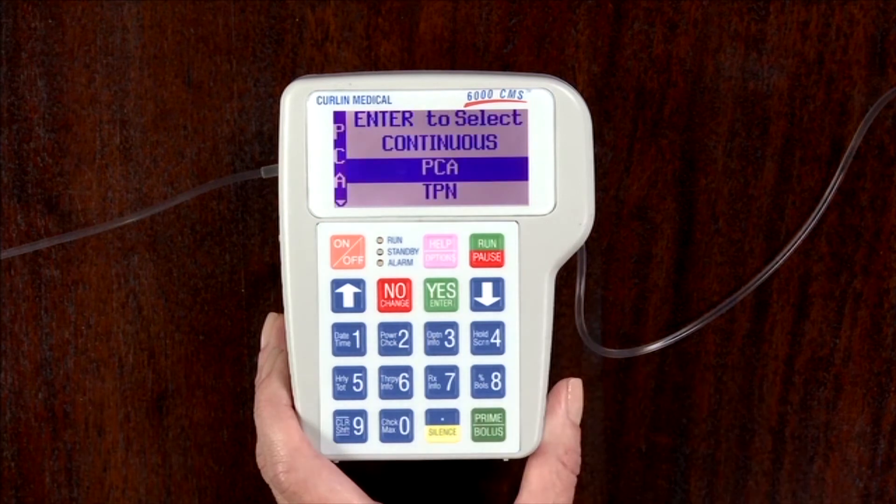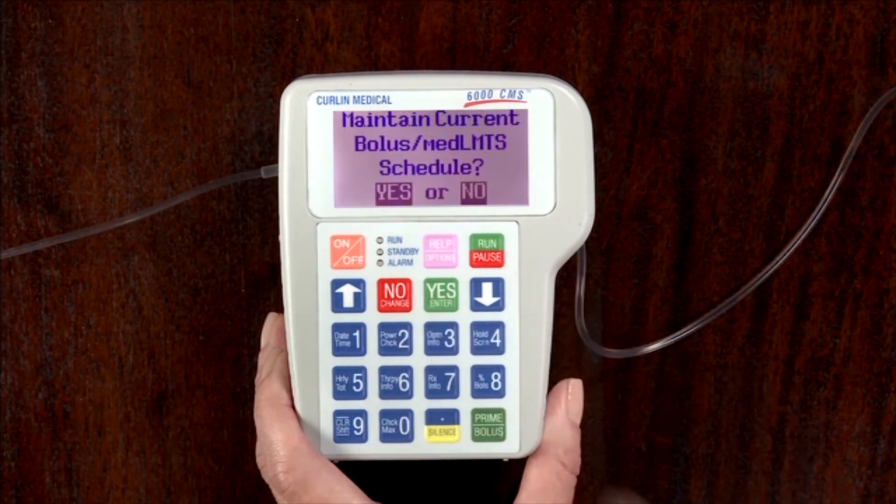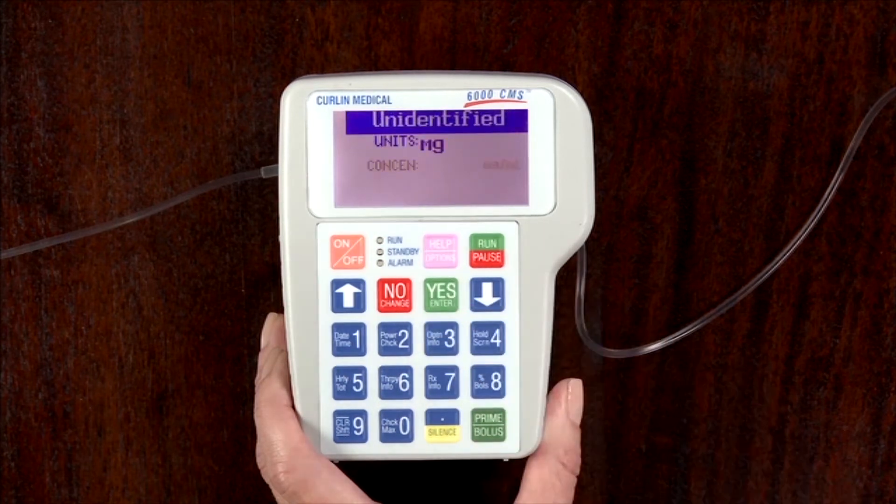Once selected, the pump may ask a question such as in the PCA mode. Answer the following which may appear on screen: Maintain current bolus or med limit schedule. Press yes enter to confirm.